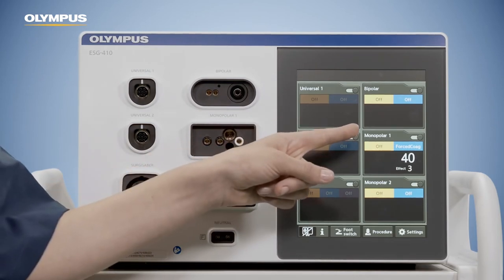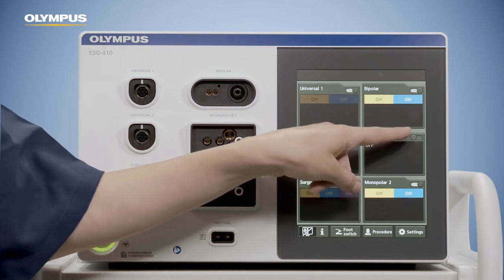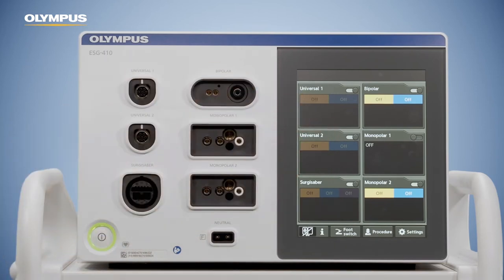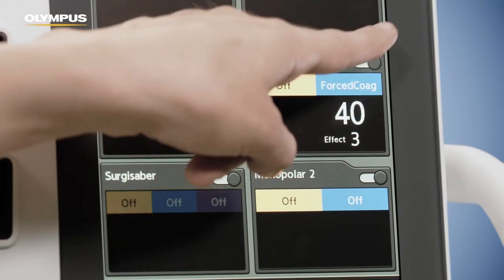If an output socket is not needed, you can switch it off by tapping the toggle key. If you switch it off, unintended activation from this socket is prevented and you may have a better overview. The socket pane is now darkened because it is switched off.